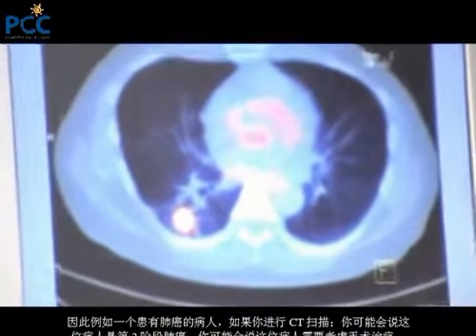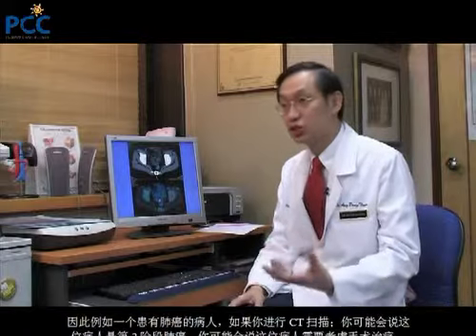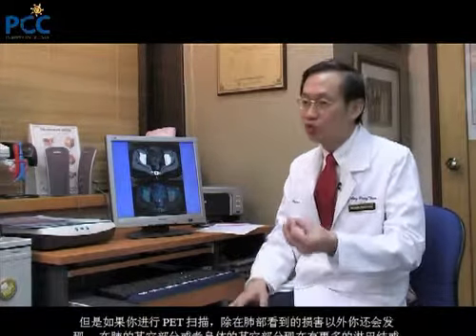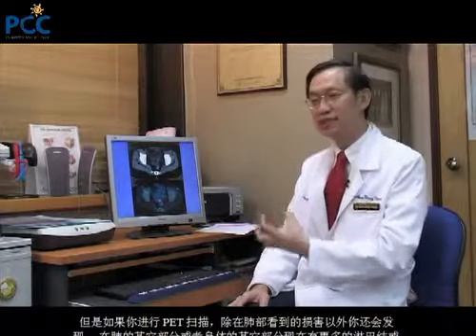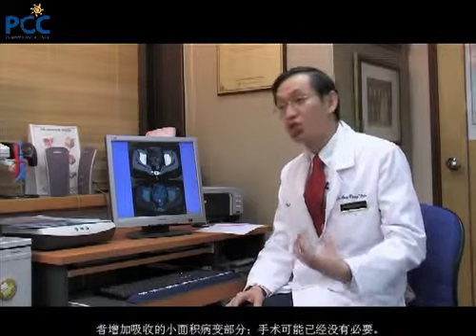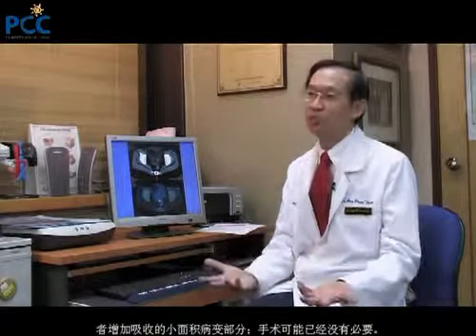So a patient who has a lung cancer, for example, if you do a CT scan, you may say, look, this patient has a stage 2 lung cancer, and this patient will need to consider surgery for intervention. But if you do a PET scan and you find that besides the lesion that is seen in the lung, there are now more lymph nodes or small areas of increased uptake in the other lung or in other parts of the body, a surgery may not be necessary.